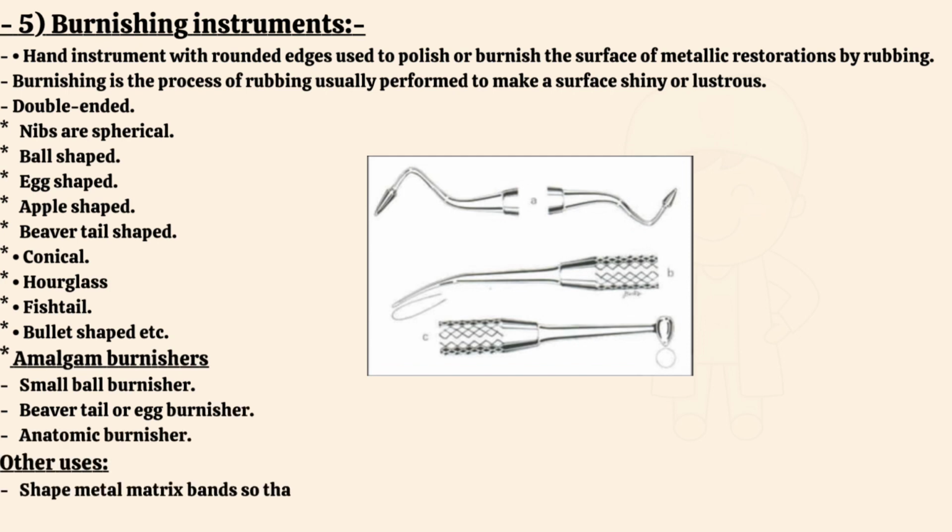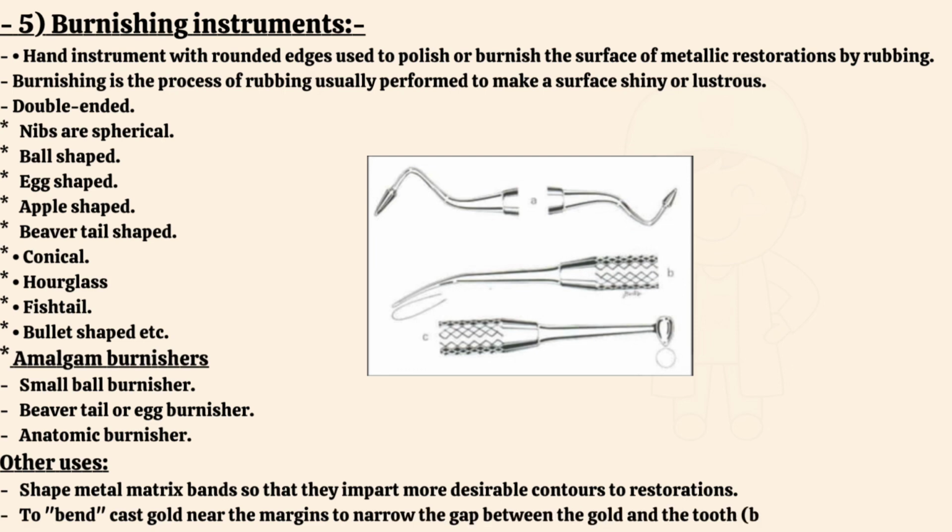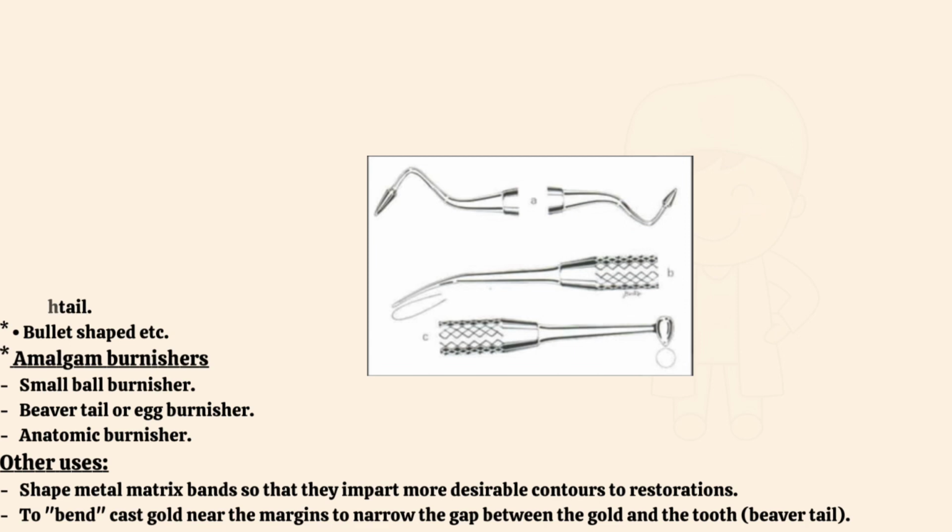Other uses: to shape metal matrix bands so that they impart more desirable contours to restorations. To bend cast gold near the margins to narrow the gap between the gold and the tooth, beaver tail.